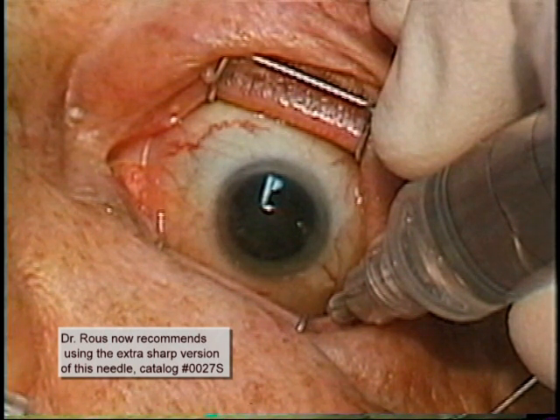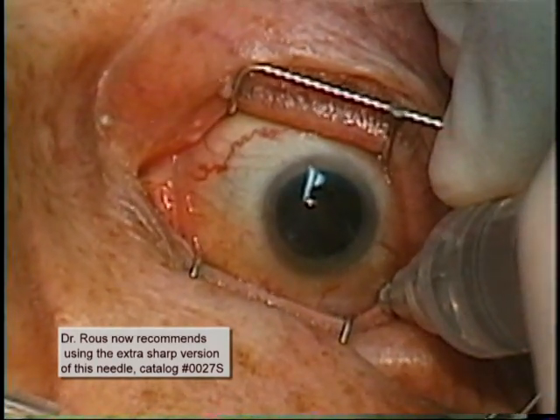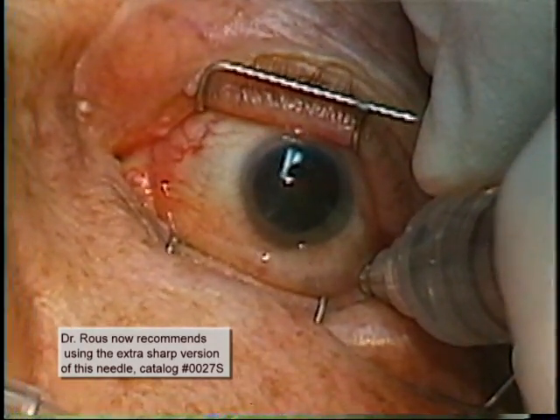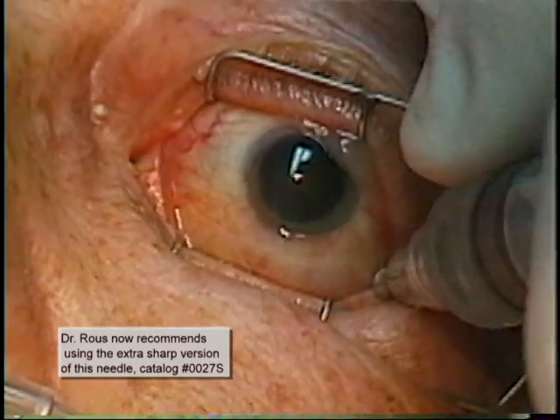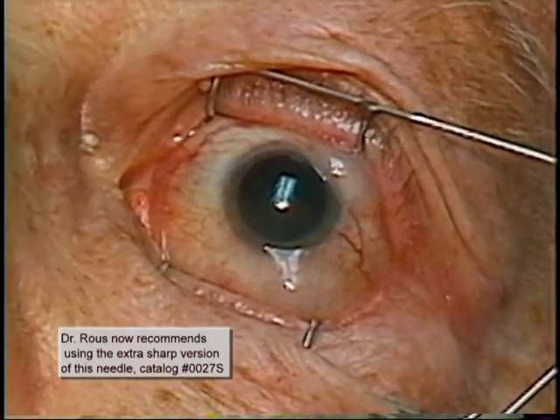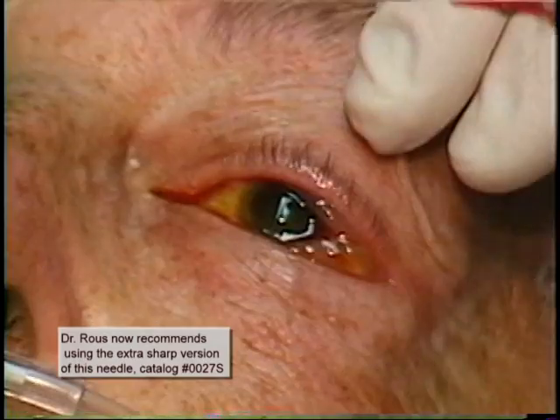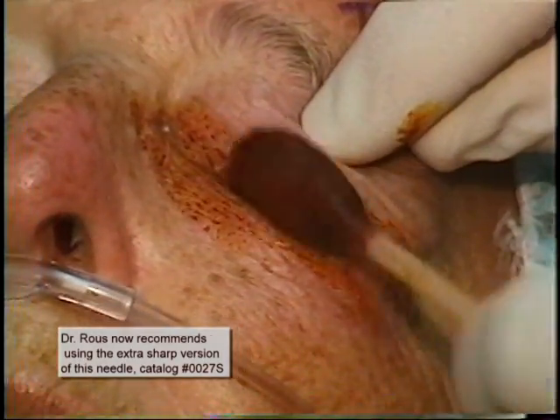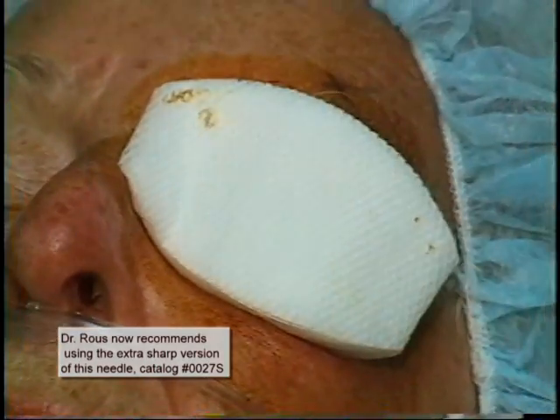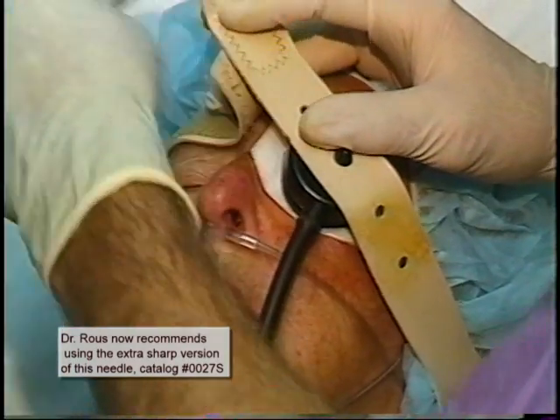There really is a very nice feel to this. As the anesthetic is injected, notice the somewhat moderate parabulbar spread inferiorly, temporally, and superiorly. This is quite common and is easily dissipated with the Honan's balloon and some digital massage. The betadine instillation, the betadine swab of the lids, the patch, and Honan's balloon placement take place in routine fashion.